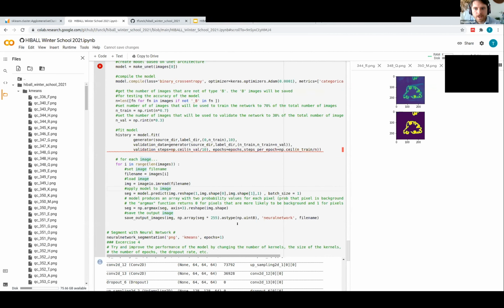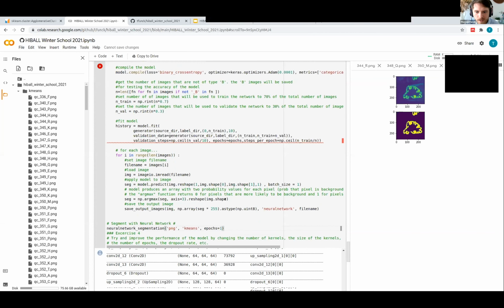But then it may fail in a handful of the sections, maybe 10% or 20%. And then you can go back over those 10 to 20% manually and correct them. So instead of going through all 200 or all 1,000 sections, you only go through 100 or 200. Then you'll have much better labels, and you can retrain your network on the new set of labels, and it'll hopefully work better. And maybe you only have to correct 5% or 10% after that. So you can bootstrap your way to having more labels in certain cases.